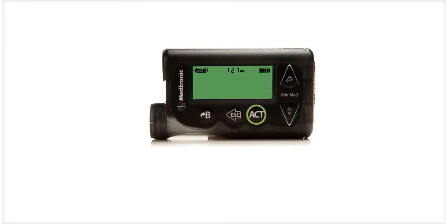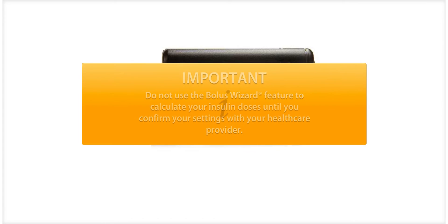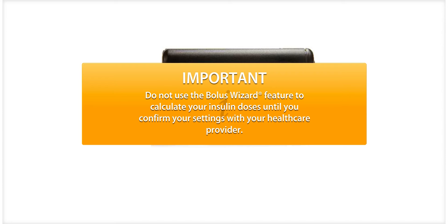Now that you know what the bolus wizard calculator can do, let's program in your personal settings. Your health care provider will help you determine the bolus wizard settings that are best for you. While you can take this opportunity to practice programming and delivering boluses with the bolus wizard feature, do not attempt to use the bolus wizard feature to calculate your insulin doses until you have discussed and confirmed the settings with your health care provider.